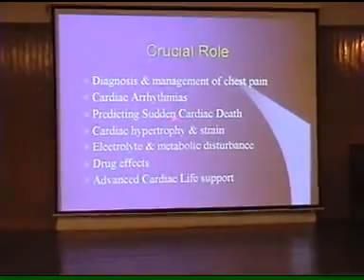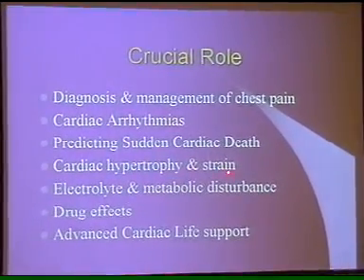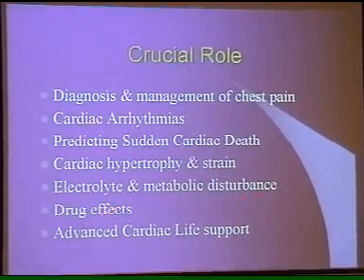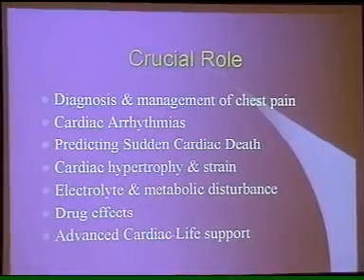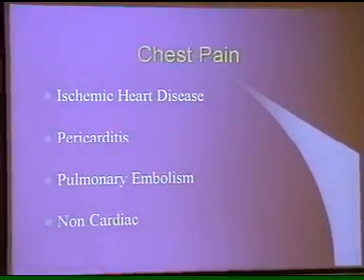The crucial role of the ECG in the diagnosis is in the management of chest pain. It is a very important instrument. Other roles include cardiac arrhythmias, predicting sudden cardiac death, cardiac hypertrophies and strains, electrolyte and metabolic disturbance, drug effects, and advanced cardiac life support.